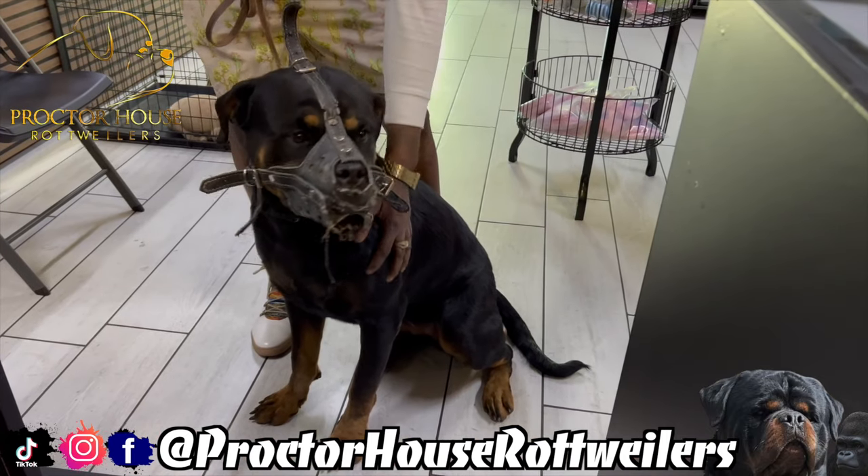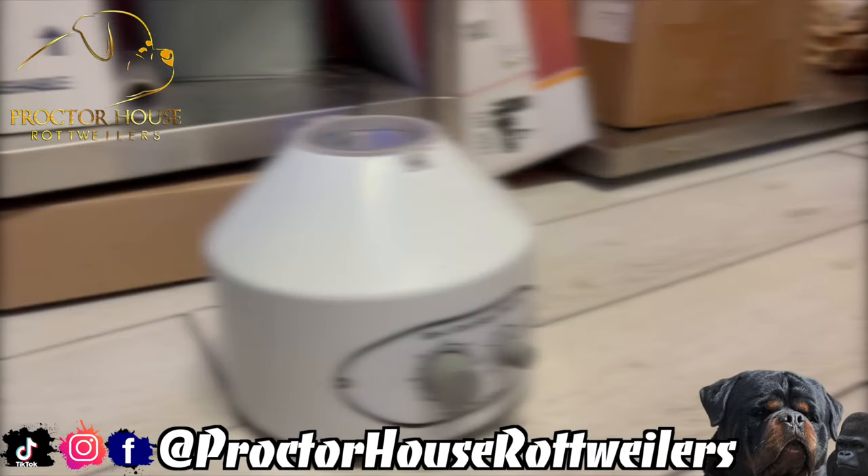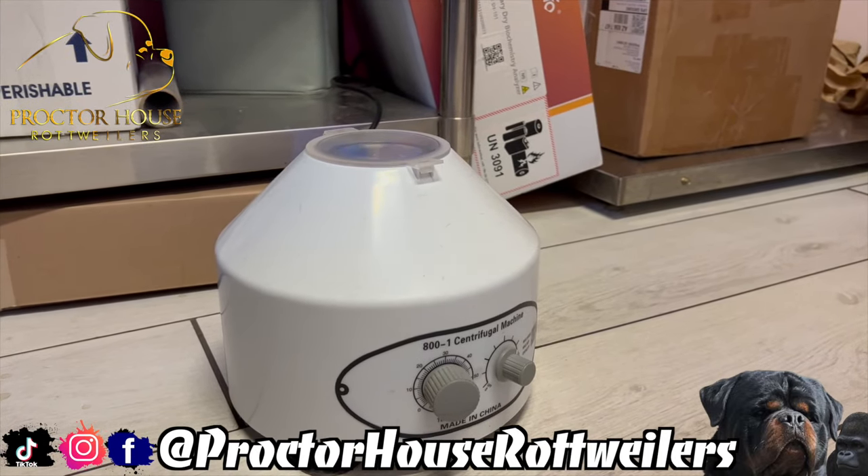Here's our girl Alpha getting some level before this TCI goes down. As you can see, we got the muzzle on for protection. And this right here is a centrifuge machine — we're going to be using this to spin down the semen.